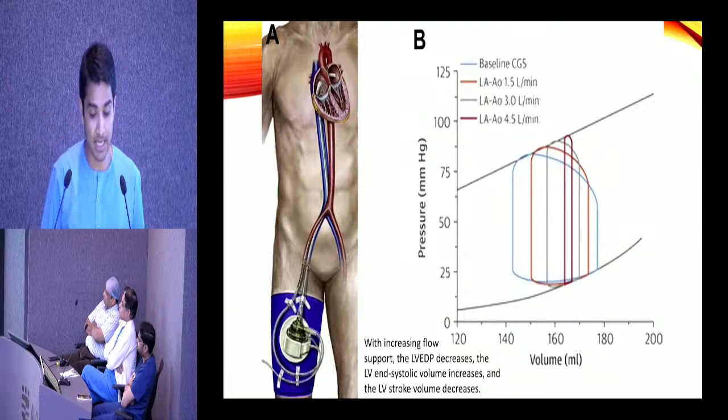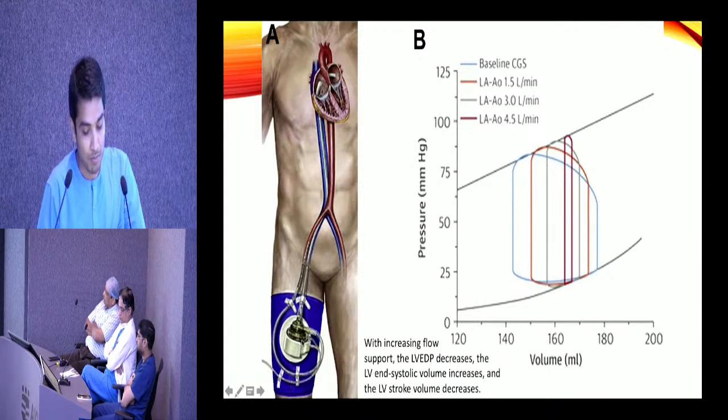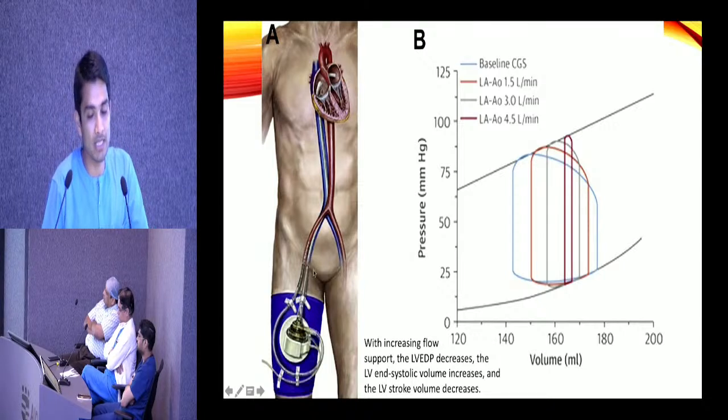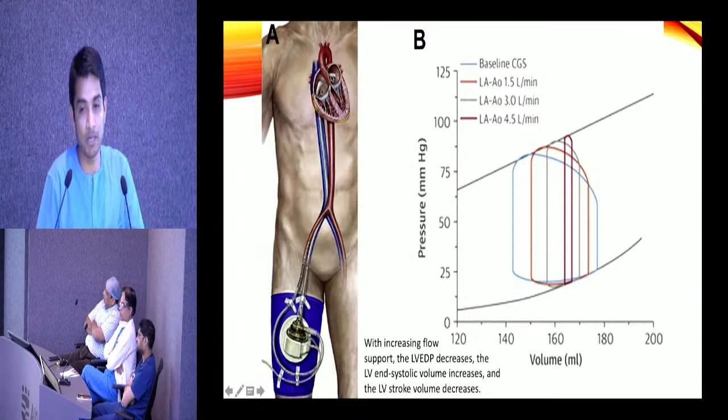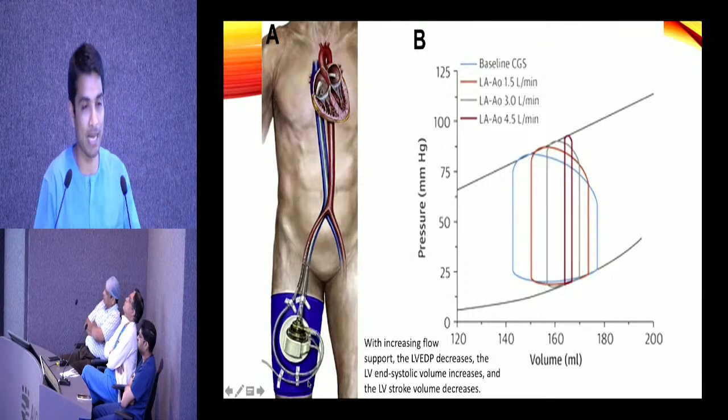As you see, the Tandem Heart patent is for this device that attaches by Velcro to this pad on the thigh, by the way. But otherwise, it's an ECMO. So we could do this with just a transseptal puncture and a cannula, which would be like an ECMO without the oxygenator, or you could splice an oxygenator on if oxygenation was an issue.